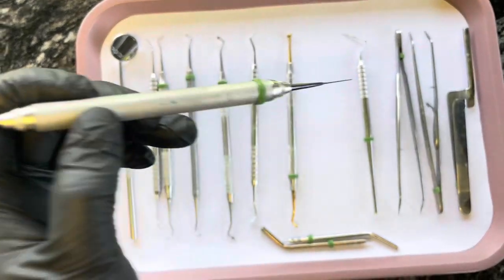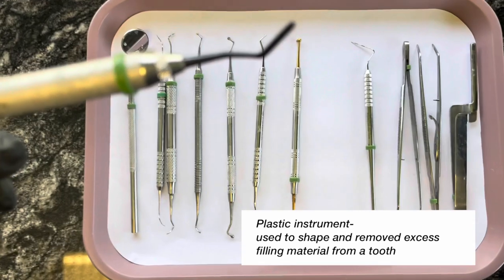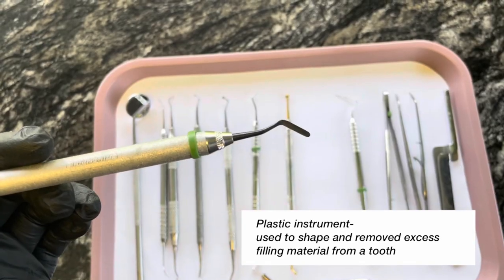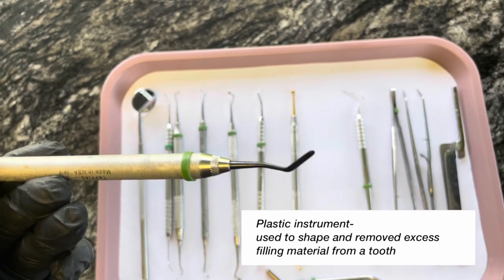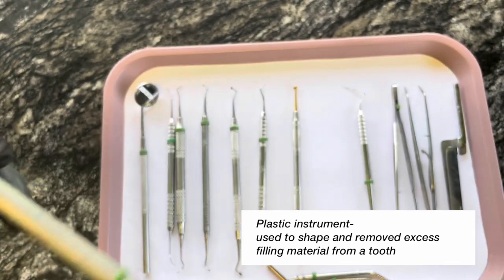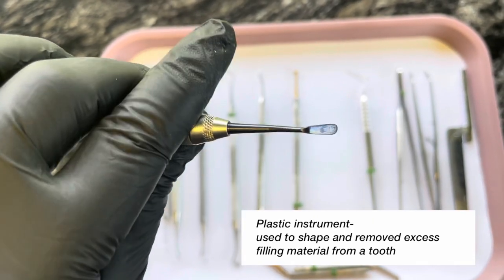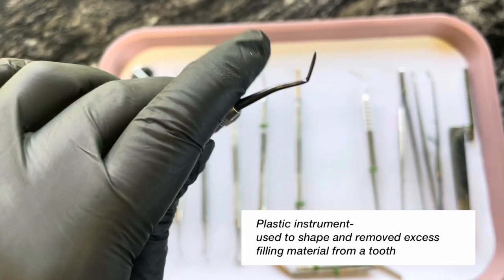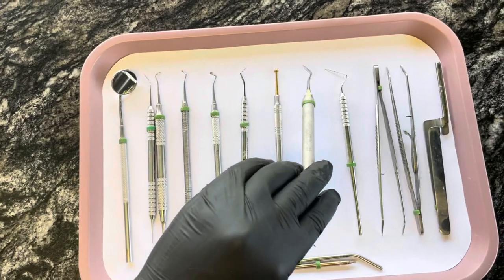Next I have a plastic instrument. This is used for composites as well, and it's flat on both sides. That's called a plastic instrument.